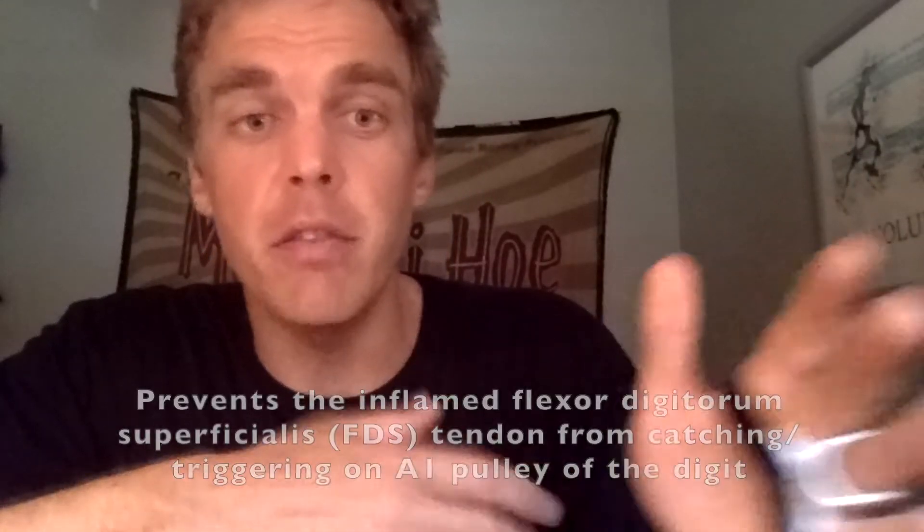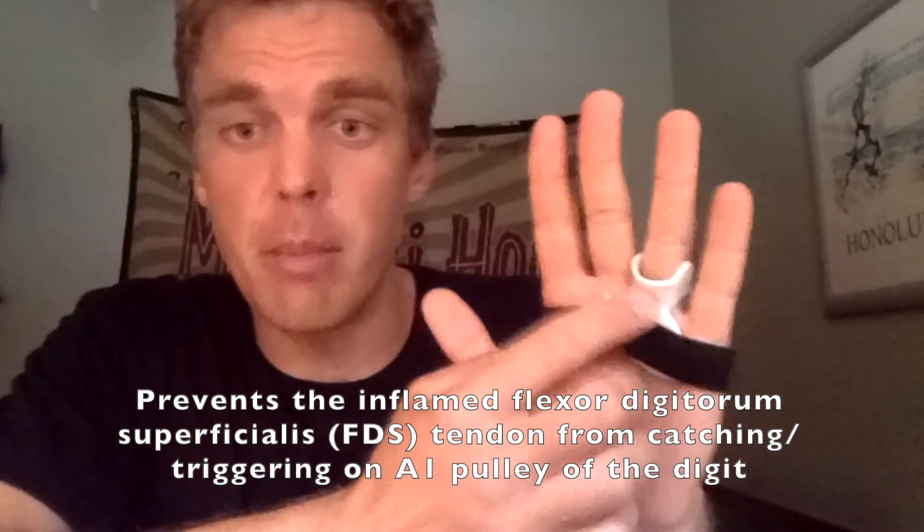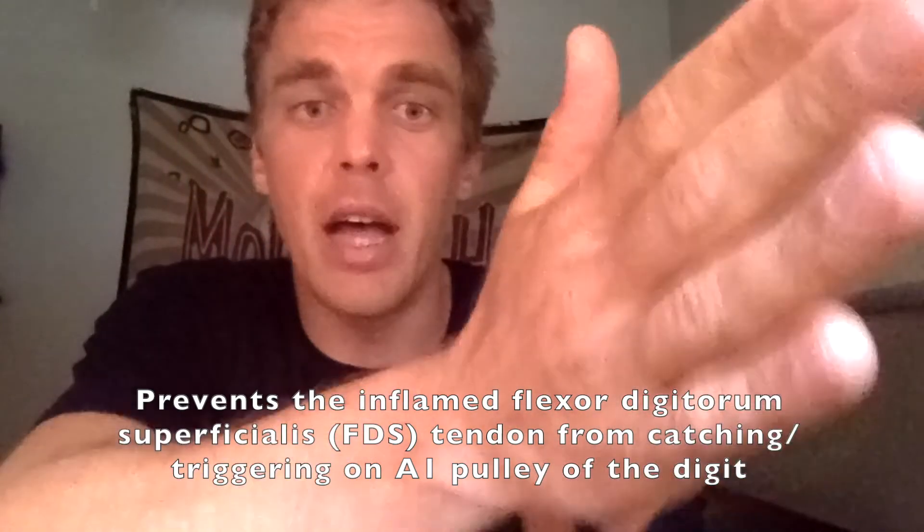We're trying to reduce the number of triggers that a patient experiences. Every time the FDS tendon — the flexor digitorum superficialis tendon — goes through the A1 pulley, which is at the base of the digit, every time it passes through that canal it creates a little more friction, like getting rug burn. If that's continuously happening, the tendon gets more and more inflamed, so the purpose of the splint is really to calm that down.